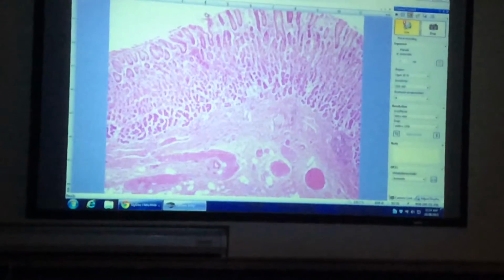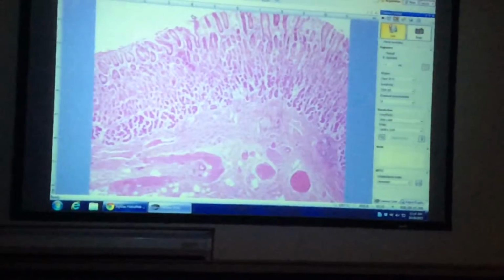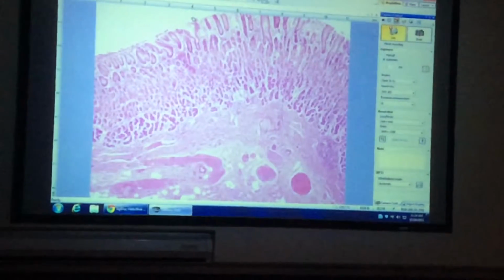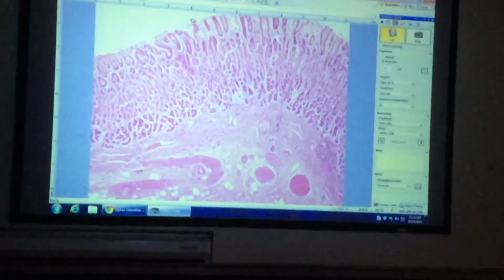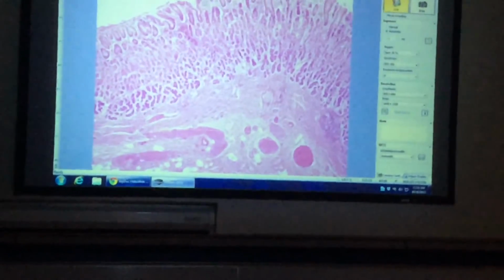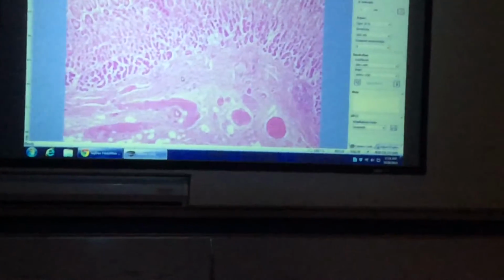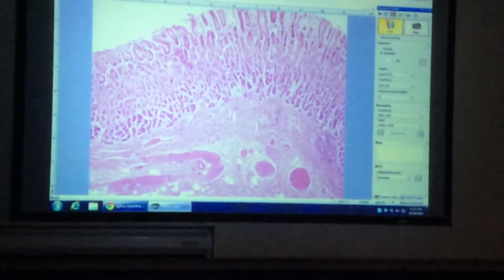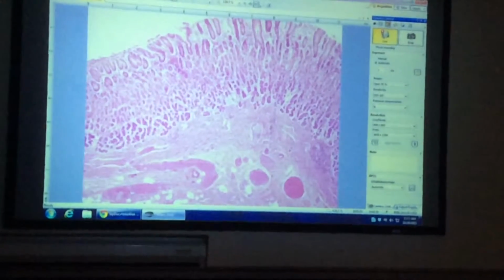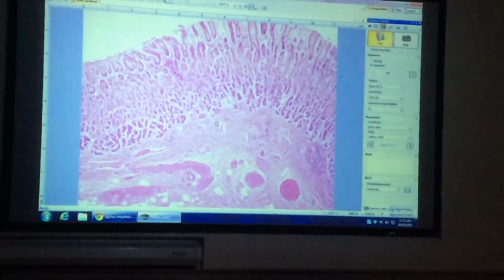Mucosa. So on a slide, I can't really point at the mucosa. I have to print something out and bracket together all three layers to show you mucosa. If I am pointing, you need to be specific. Simple columnar epithelium, lamina propria, muscularis mucosa. Right? The only way I can show you mucosa is by bracketing all three of those parts together. That's the mucosa. Yeah? Okay.